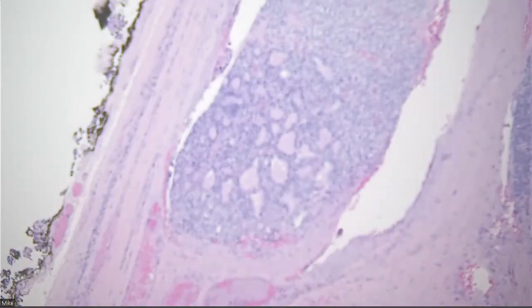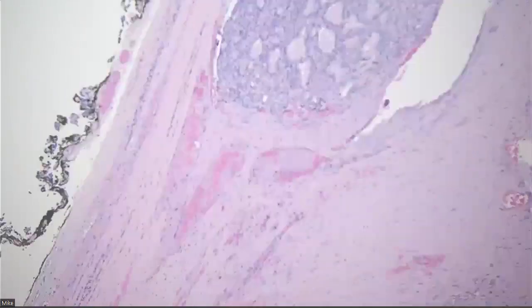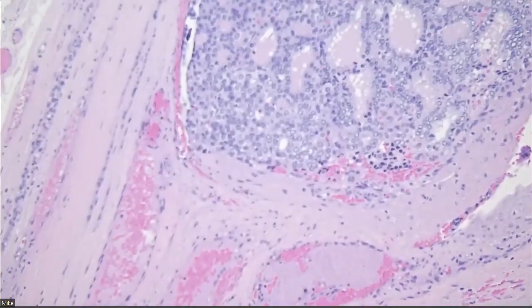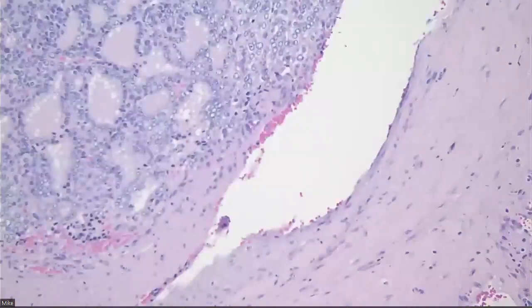So the one thing on this slide that worries me is this. Okay, so is it L or is it B? Angio, yeah. So in thyroid now we have to discriminate between lymphatic and angio invasion.